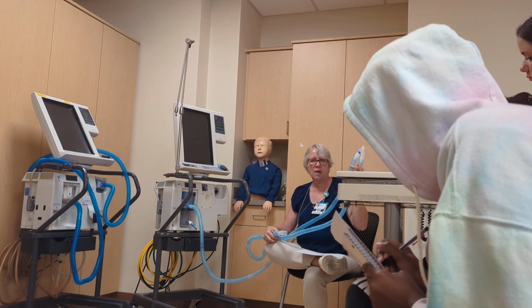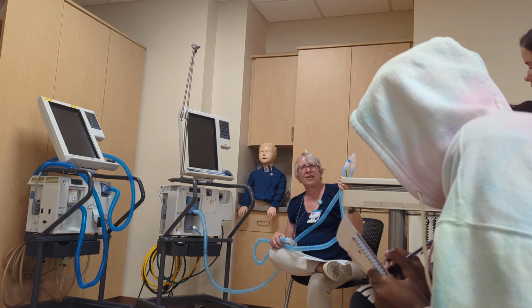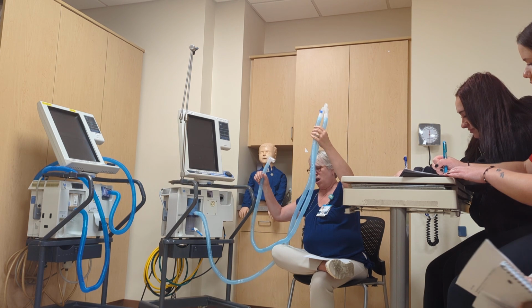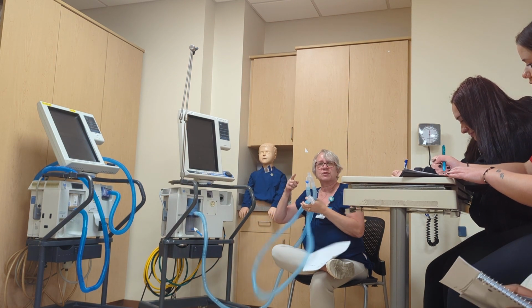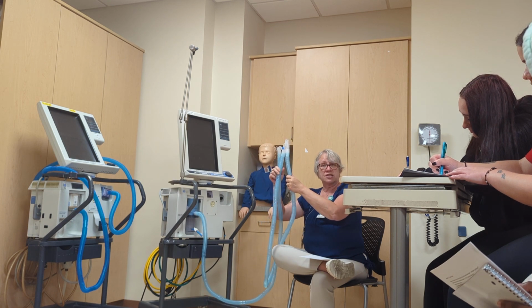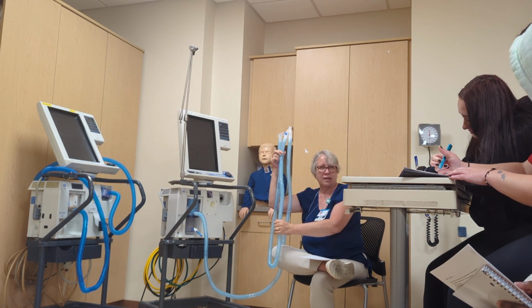All right, then you have large bore tubing. It's this blue tubing, it's called corrugated tubing. But when you build this, you have an inspiratory limb and an expiratory limb.